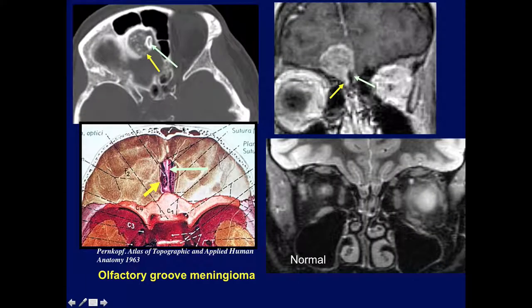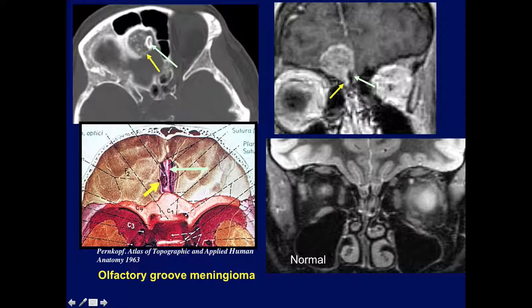Here is another unilateral olfactory groove meningioma extending down towards the cribriform plate. Notice the crista galli here. On CT there's no doubt this is a meningioma — we see long-term bone erosion and the small calcification characteristic of meningioma. On the coronal MR, the crista galli is visible with the tumor expanding into the region of the cribriform plate.